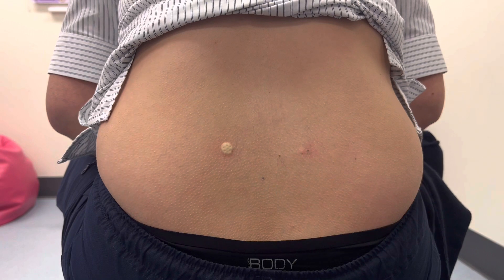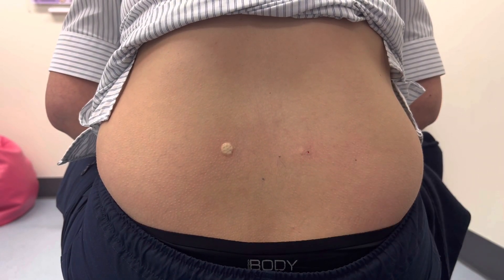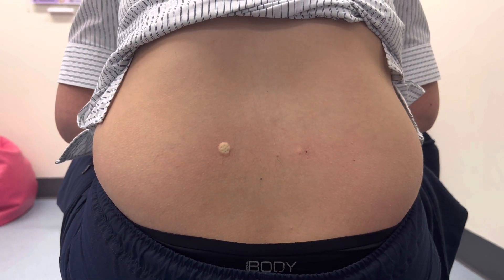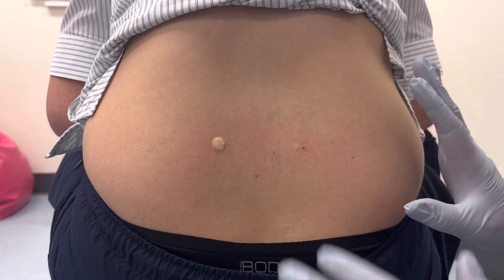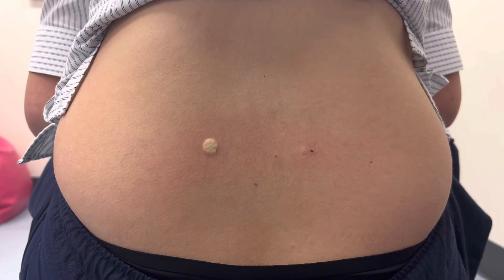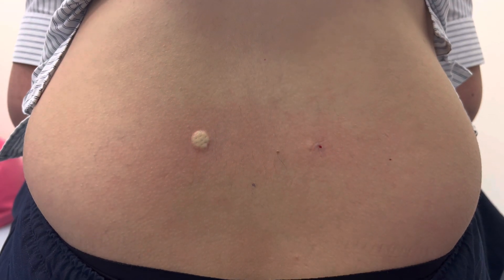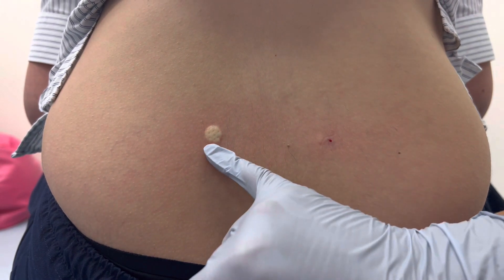A nice bleb formed there, though not as much on this side — this side went a little bit deeper. Remove the needle, then tell the patient not to touch the area, not to put anything on it. The stinging should start to relieve in about 30 seconds.